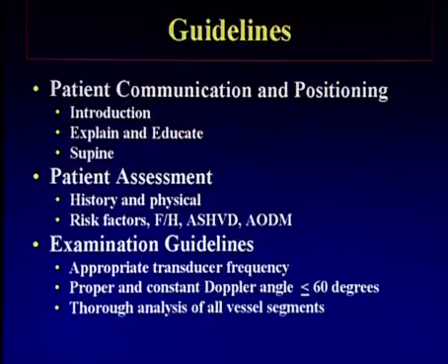The next section is the examination guideline. In that section, you will note the type of frequency you want to use, the type of transducer, the angle of inclination that you would like to maintain, which is most likely going to be 60 degrees throughout the examination, and the vessels that you will be interrogating themselves.